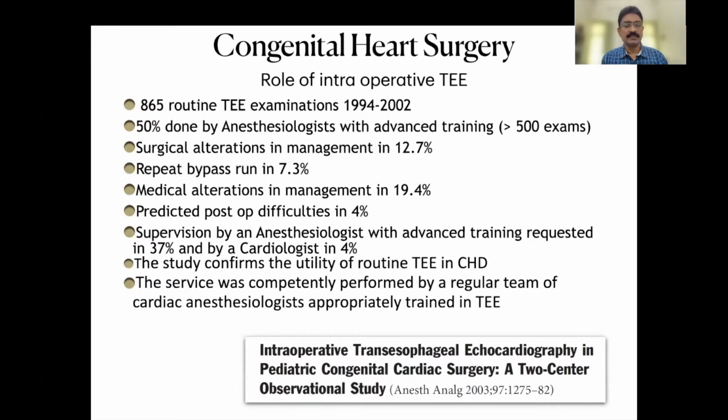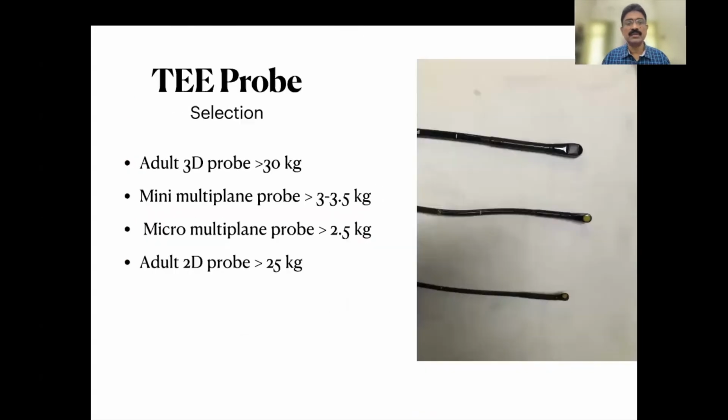If you see the importance of a cardiac anesthesiologist trained in pediatrics compared to the cardiologist, the supervision of such a person was requested in 37% of the cases. So this study confirmed the utility of routine TEE in congenital heart disease, and this service can be competently performed by a regular team of cardiac anesthesiologists appropriately trained in transesophageal echocardiography. So that is the importance of this topic.